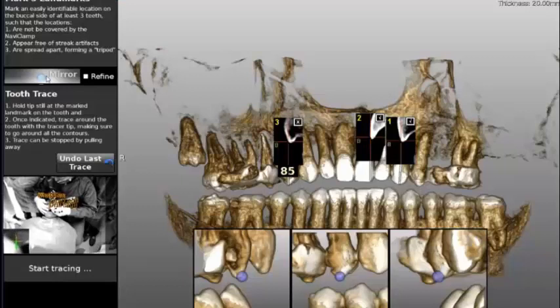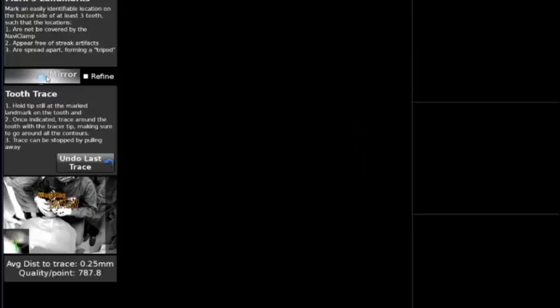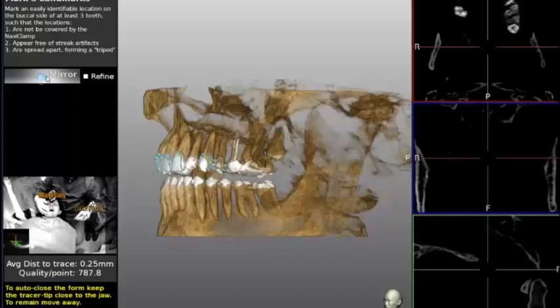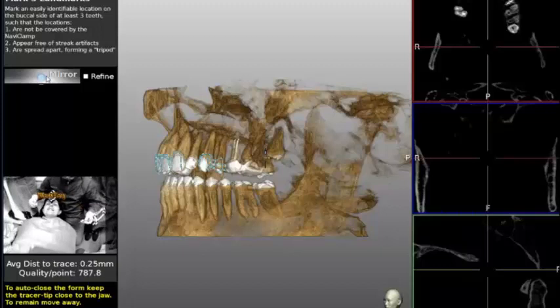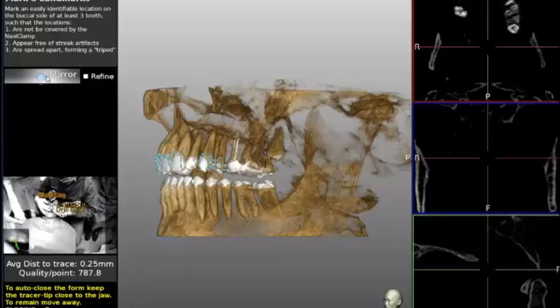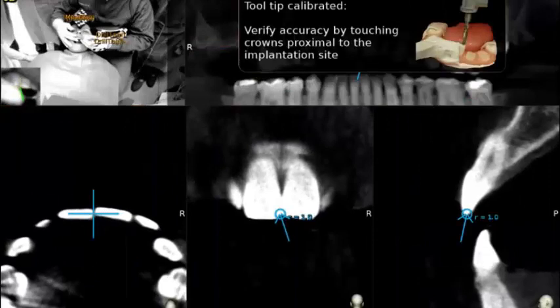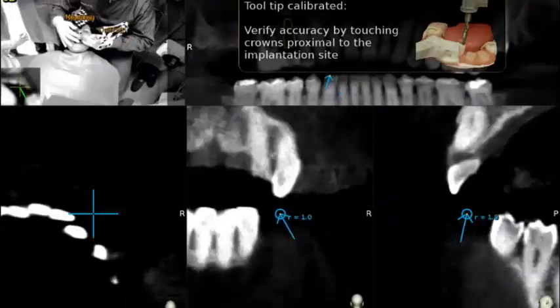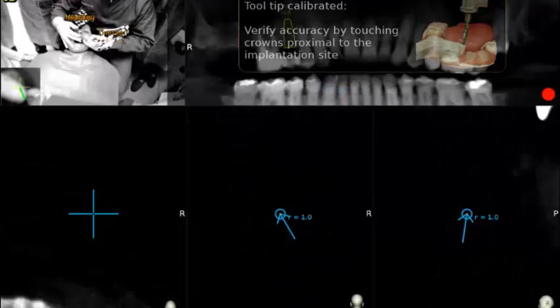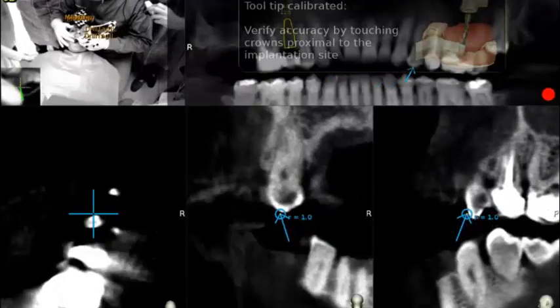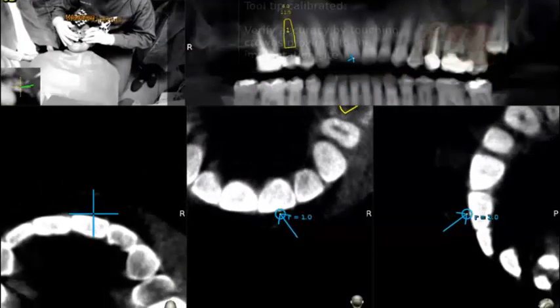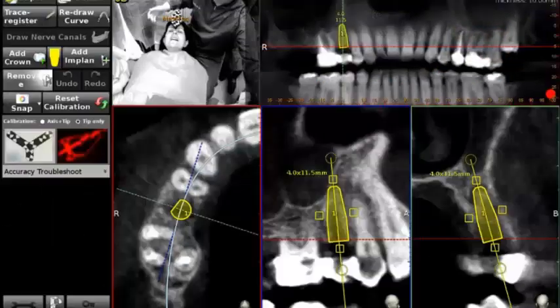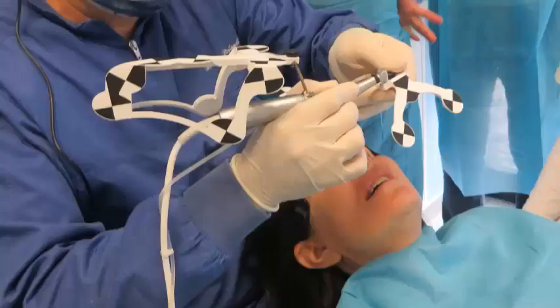While we are finishing the third tooth, automatically the software matches the volumetric mesh of the three teeth onto the DICOM files, as we can see on the picture. Soon after, using the tracer, we measure the accuracy by touching any tooth on the maxilla, basically proving that the whole process went well.